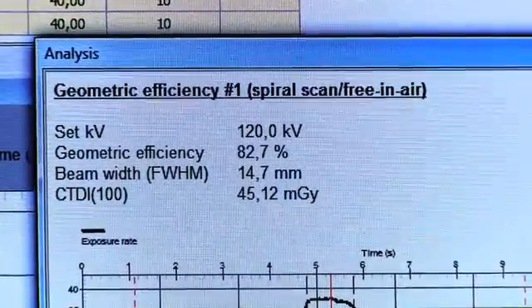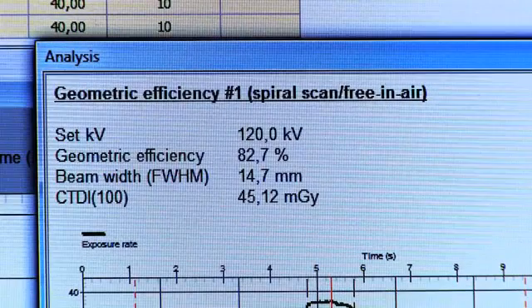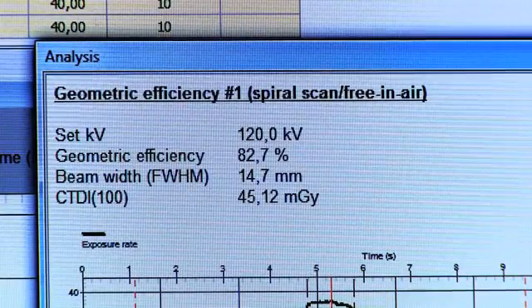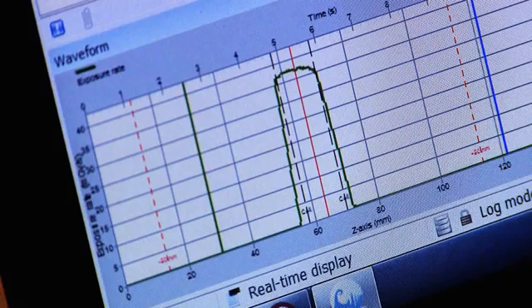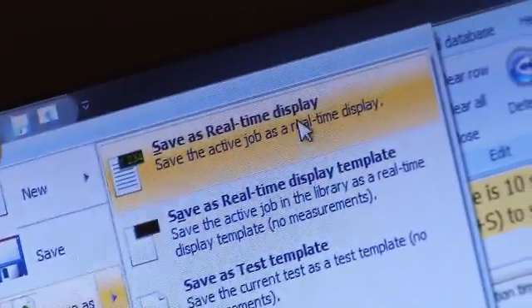The geometric efficiency should be greater than 70% or the CT will issue a warning. The distance between the two black lines is the collimation. Save the data.